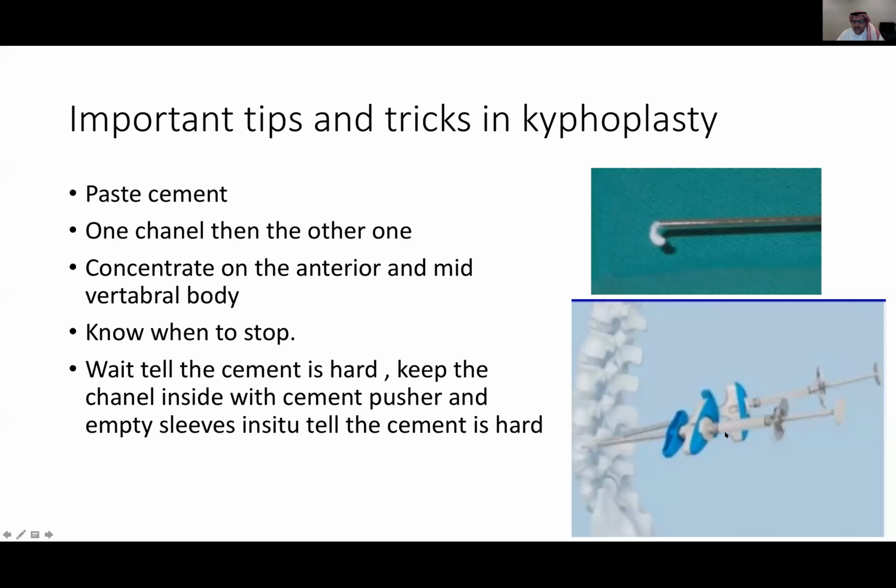It may be very difficult to control your hand and your colleague's hand. In ballooning, no problem, but in cementing, I think it's better to do it yourself, one person. You do one side, maybe you don't need to push the whole side inside, but a little bit from here, a little bit from here, and you concentrate and make sure that you are the one in control and see the screen. You need to know when to stop. You need to know when to stop the cement.